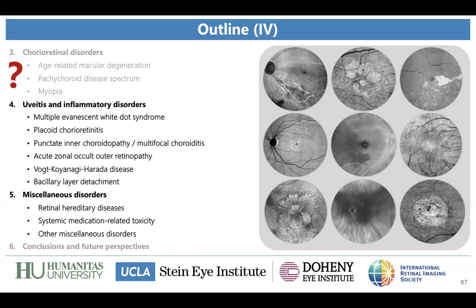So we can actually repeat it as many times as we want, which is something that maybe with ICGA we cannot always do. And so for sure, I think it is a very great point. There are a few studies, but actually en face OCT in pachychoroid, I think, is still a relatively underexplored field. So it will be very interesting to apply this technique to further study this topic.